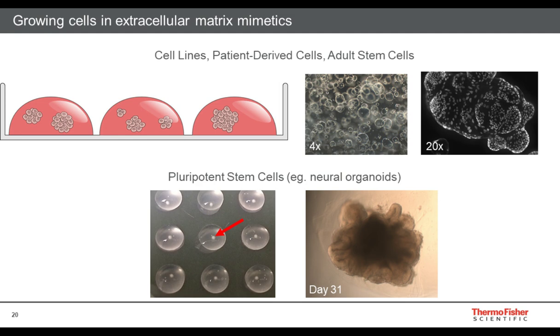So adult stem cells are grown in this way, where cells isolated from tissue are resuspended or reconstituted inside of an extracellular matrix. And many of them grow into what almost looks like bubbles inside the gel. So they form these cystic-like structures, but if you actually stain them with something such as DAPI, you can see that there are these cellular models. These are lighting up all the different nuclei, representing all the different cells in a given model shown here on the right. But this really only works if you're growing cells inside of an ECM.